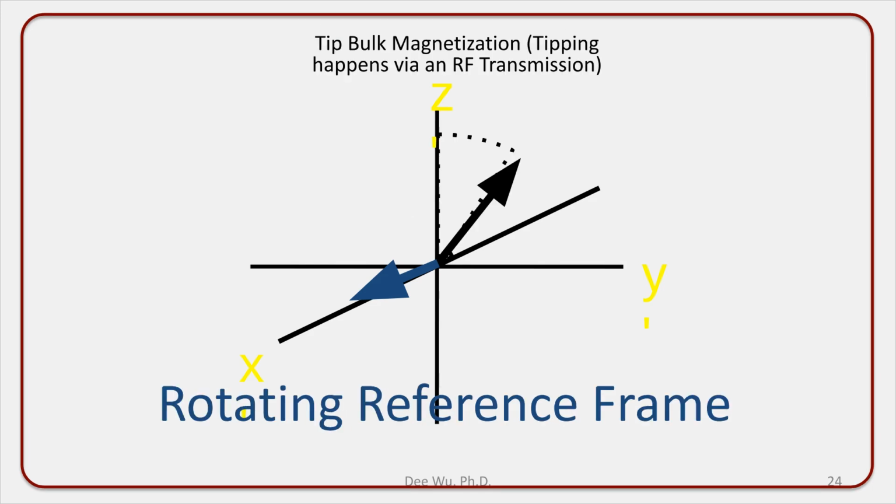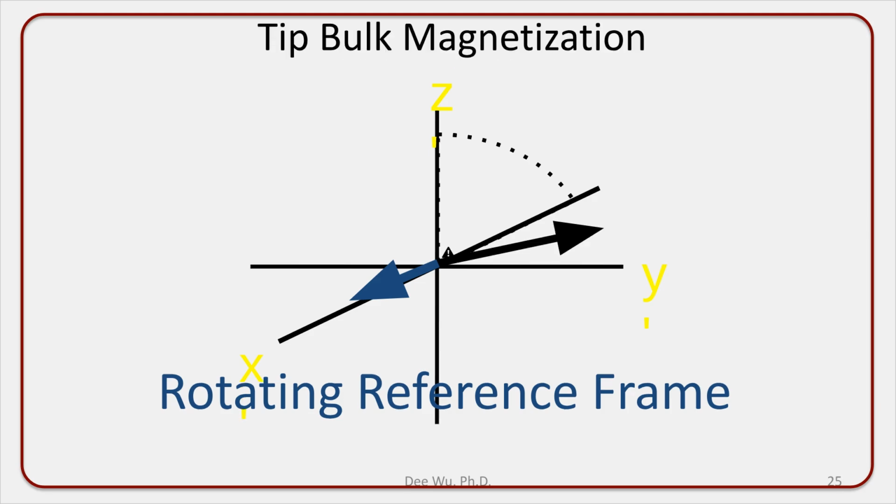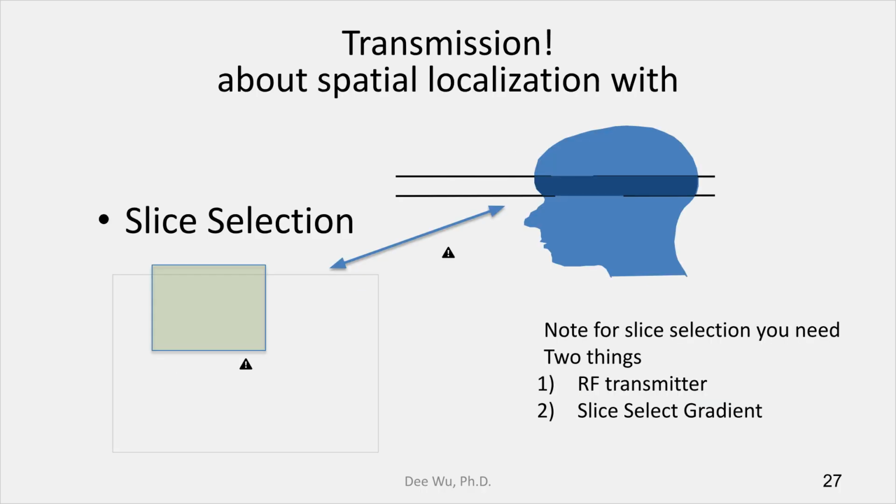Let's define our terminology. Key elements include the radio frequency pulse, slice, frequency, and phase gradients, alongside repetition and echo times. The RF pulse tips the net magnetization, while gradients provide the spatial localization necessary to know exactly where in the body the signal is originating. When we analyze the RF transmitter, its primary job is to flip the spins into the transverse plane. Without this step, we cannot generate a signal to measure. And during that RF application, a slice select gradient is essential to ensure we are only exciting the specific anatomical plane we wish to image.